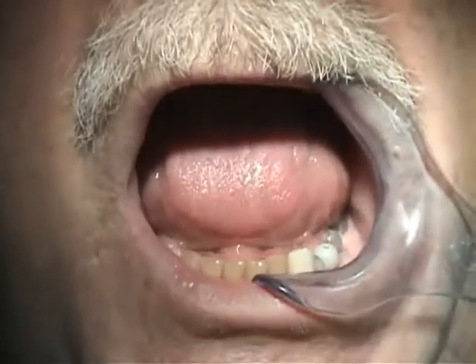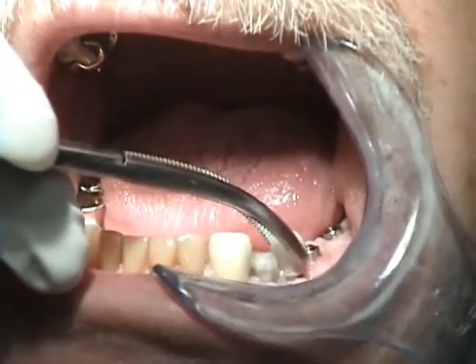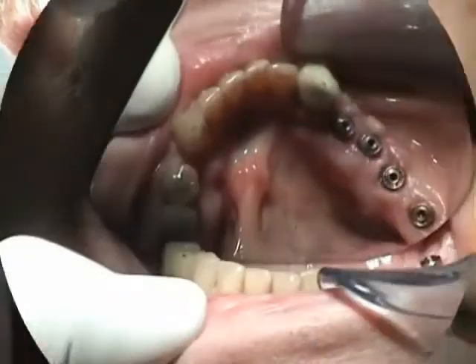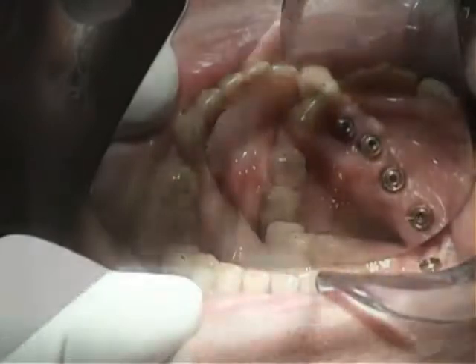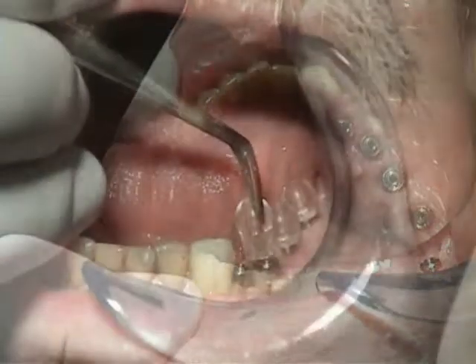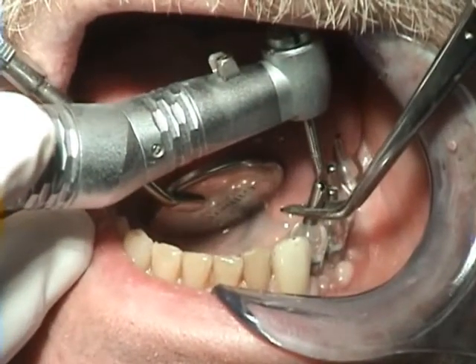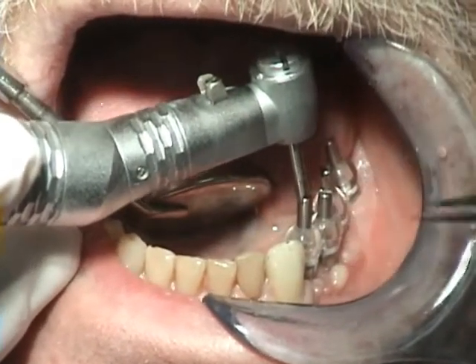Are you taping already? The box that I... I don't think we need to adjust a lot more.